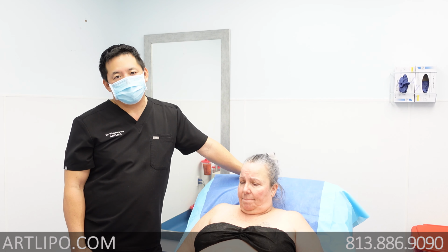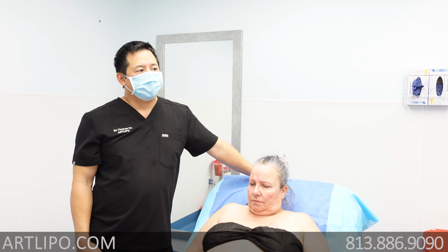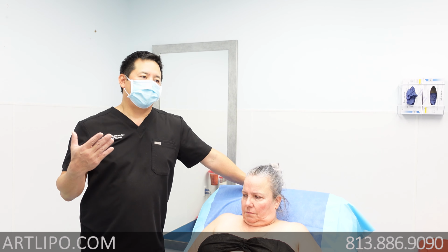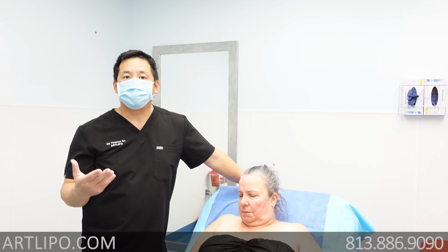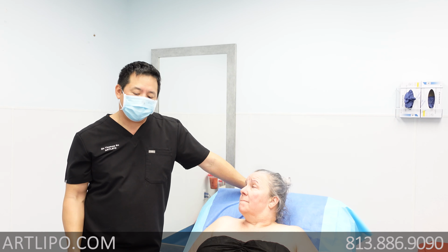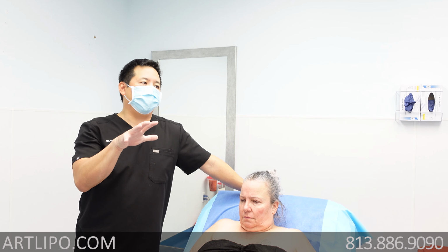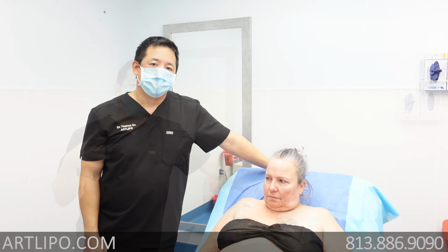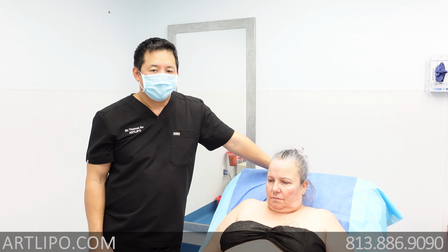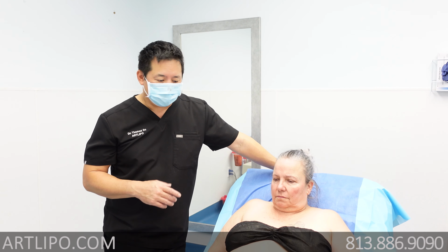Yeah. And I asked Susan to make her comments, and she's probably not expressing as much as I would have expressed for her, because I see patients all the time, and some people will have quite a bit of stinginess, and Susan's been tough this morning. She's endured quite a few areas where I was grabbing, and it hurts there. So anyways, when we do encounter a lot of soreness and stinginess in different areas, we have the ability to add extra lidocaine.